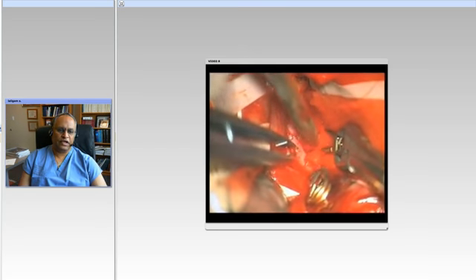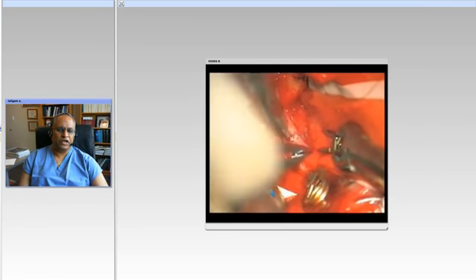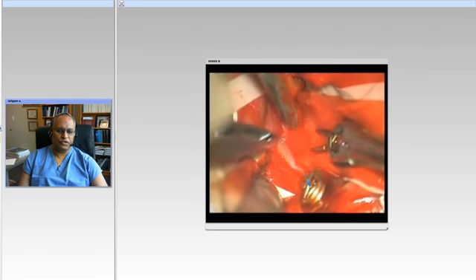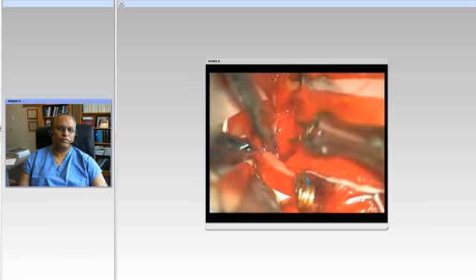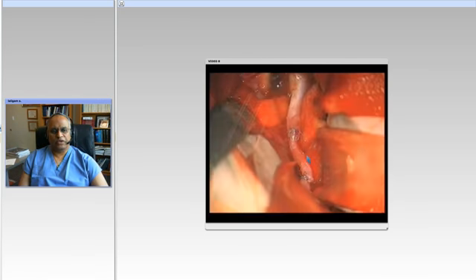I think that we can look at the end terminal portion. Here is the graft, temporary clips being released, and you can see the proximal anastomosis and this anastomosis. And this patient actually has done very well. And just trying to make sure that we have no leaks. Sometimes you have one or two leaks which you may need to fix with a stitch.